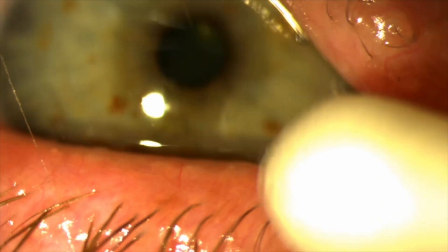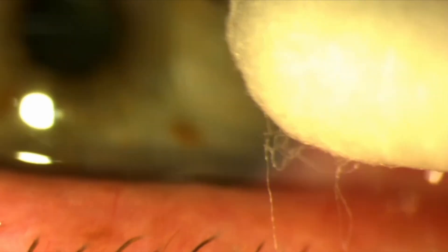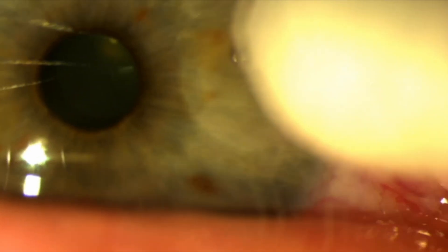Once close, look down the eyepieces for a magnified view and slowly and cautiously move the cotton bud toward the foreign body with a gentle upward or rolling movement. Most foreign bodies will come away.